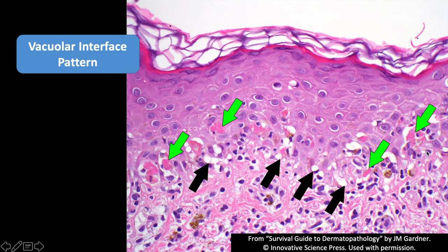A quick test for interface dermatitis: can you easily draw a line where the basal layer of the epidermis or the basement membrane is? Not really here — it's kind of blurry. See how it's blurred? It's not a clear-cut interface between the epidermis and dermis. Whenever I see that, it instantly makes me think there's interface dermatitis. Then I go look for scattered lymphocytes, vacuoles, and dying keratinocytes.